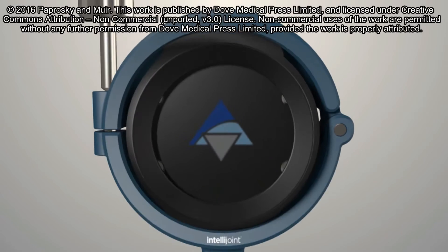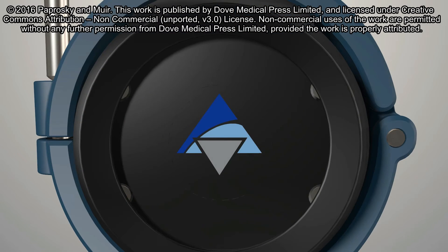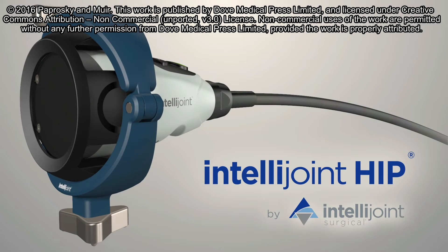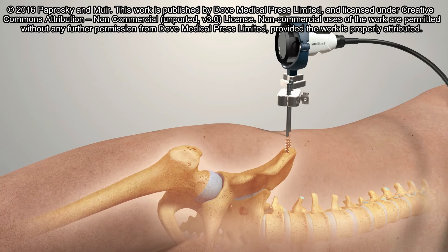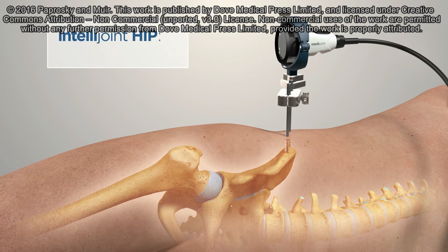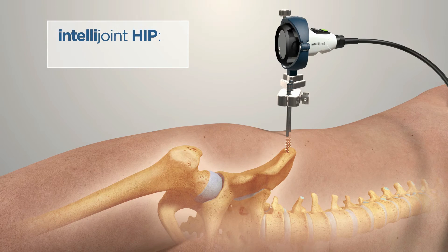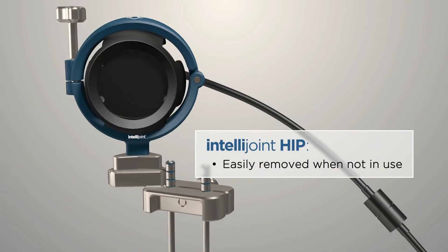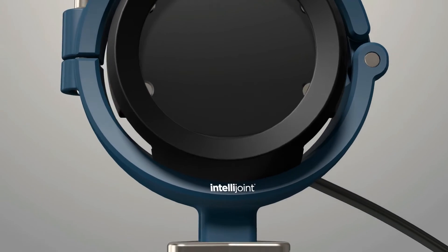IntelliJoint HIP is a 3D mini-optical navigation tool that provides surgeons with real-time intraoperative data on leg length, offset, and cup position. This allows for confident selection of the correct implant in order to ensure appropriate post-surgical biomechanics. This breakthrough technology is encapsulated in a single miniature camera that is attached directly to the pelvis. The camera can be easily removed via magnetic mounts when not in use to eliminate any interference with the surgical workflow.